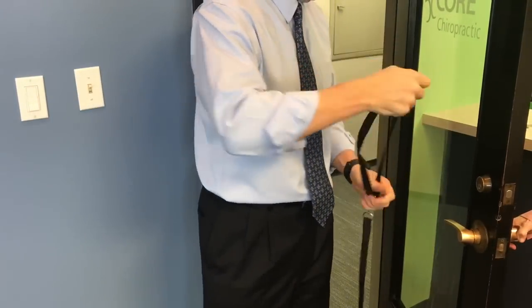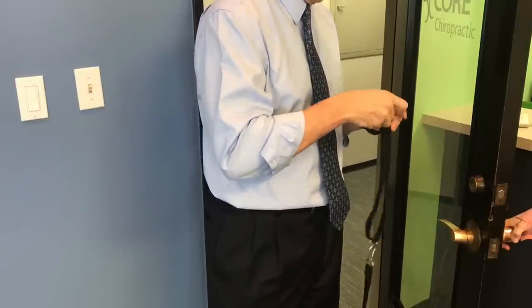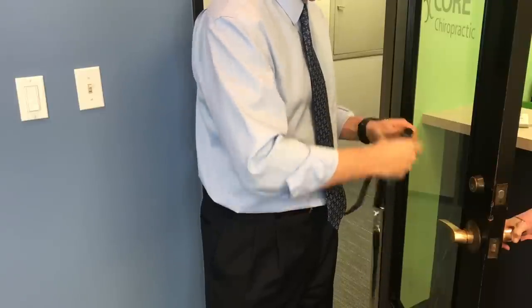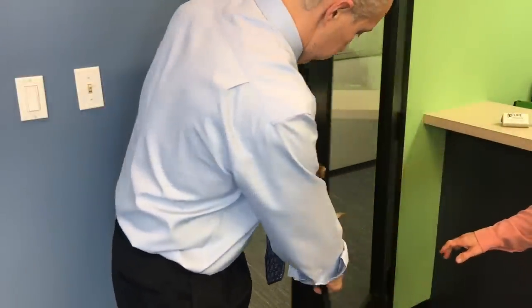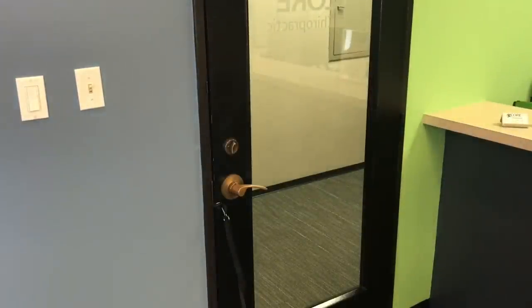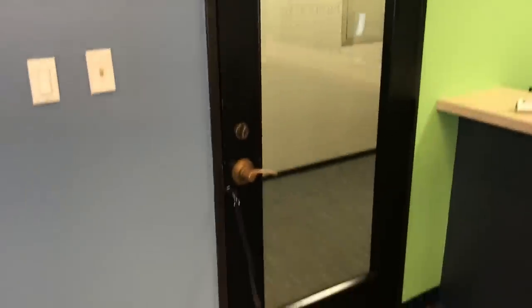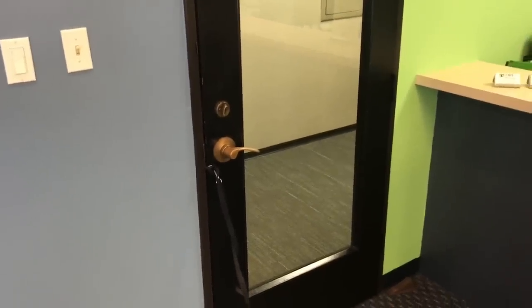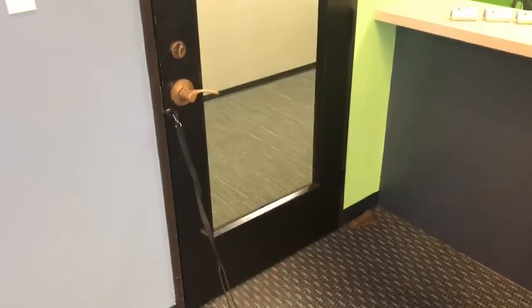So again, I have this strap and you're supposed to attach this to the doorknob and then close the door. You can see that by doing that, it ends up on the floor — so that's not going to work. If I try to attach it to the top of the door, that's way too high. So even a regular standard door in a house, I don't think that's going to work based on how they're saying. We can do this by hand and get an idea of how this is supposed to work.